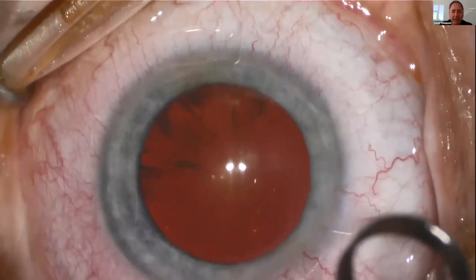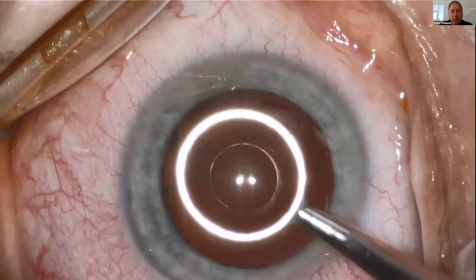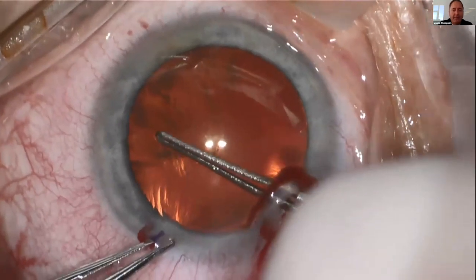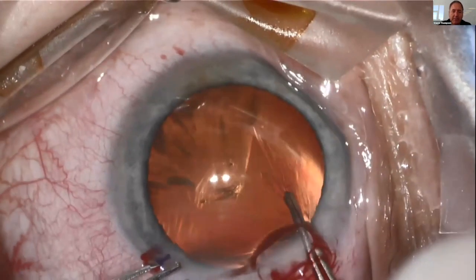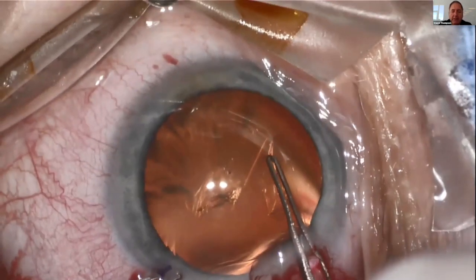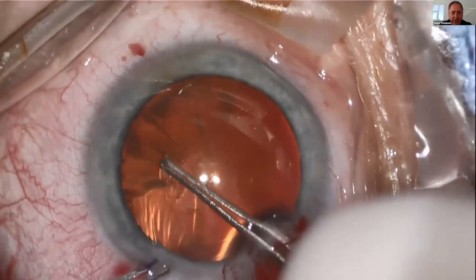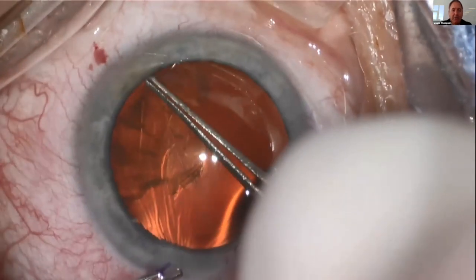So I can do this manually if I have to. This patient was another one where I could use my manual technique, mark the corneal surface, and then perform my manual capsulotomy. This step deserves the time and effort. I call it a refractive capsulotomy because it's so important for long-term implant centration and to minimize any decentration.